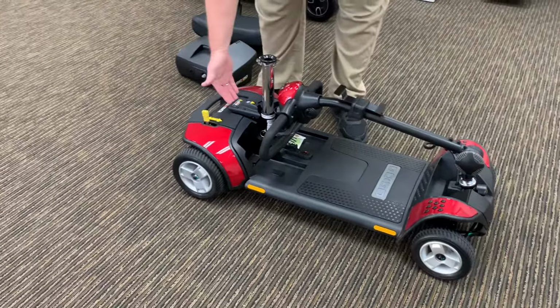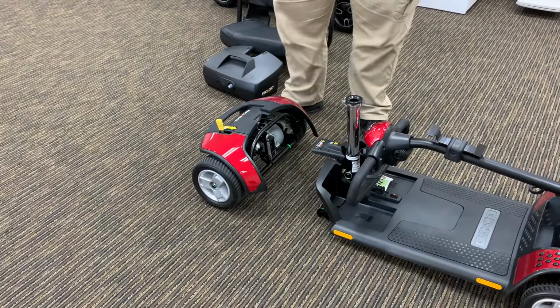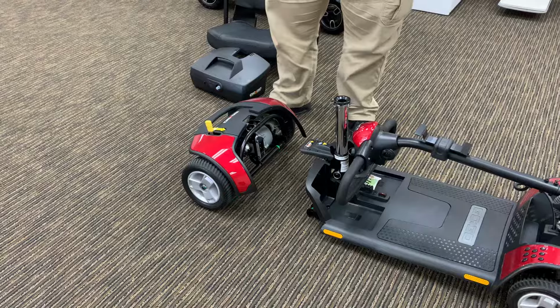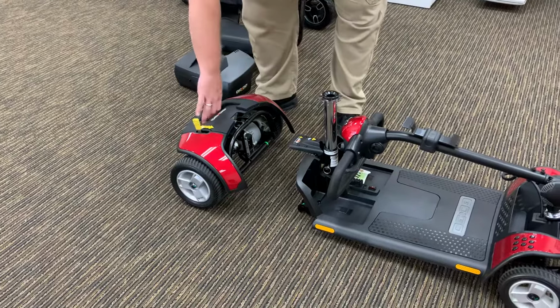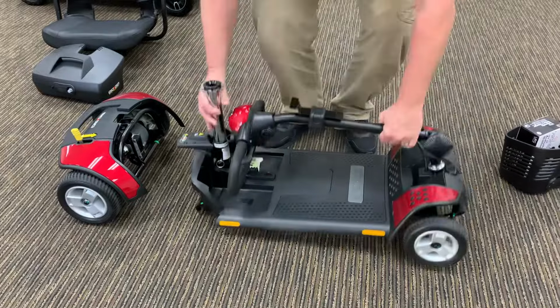So right here, you pull up on this handle, pull straight up. If you notice, I'm not doing anything with this hand, just one hand, pull straight up, it separates the body. You have your handle here to pick up, and then this can be picked up just like that.